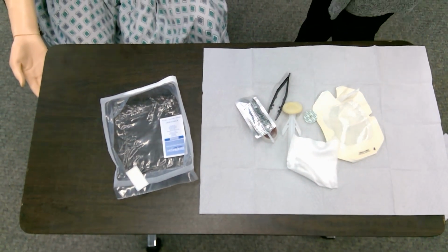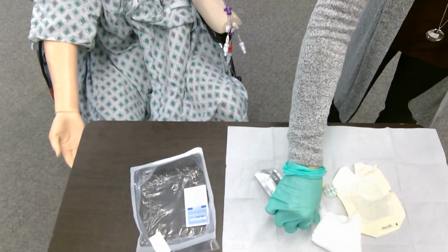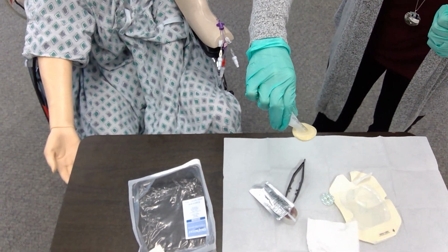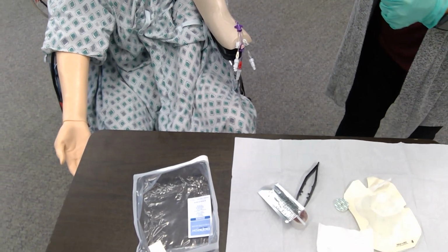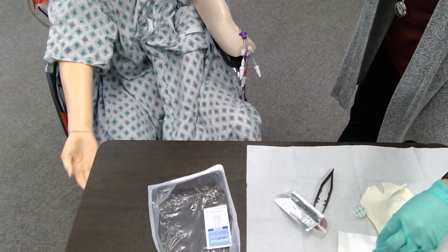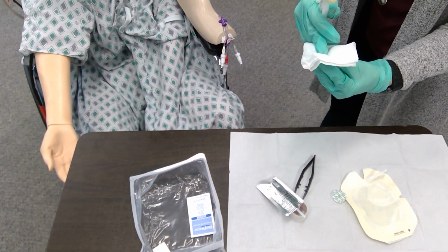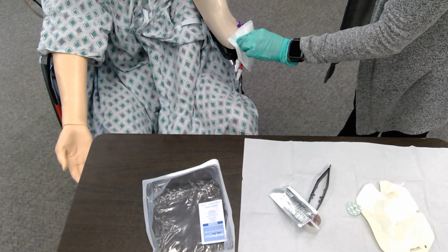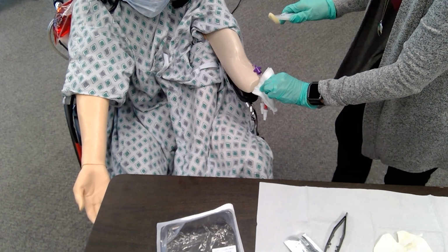Okay, so the priority here is to clean this insertion site. What I'm going to do first is break open my ChlorPrep. So this contains chlorhexidine. You break it open and then you shake it a little bit so that the liquid comes down. In order to not contaminate your hands at this point, I'm going to take this 4x4 here and hold it like this, and I'm going to pick up the line in this 4x4 so that I don't contaminate my gloves.